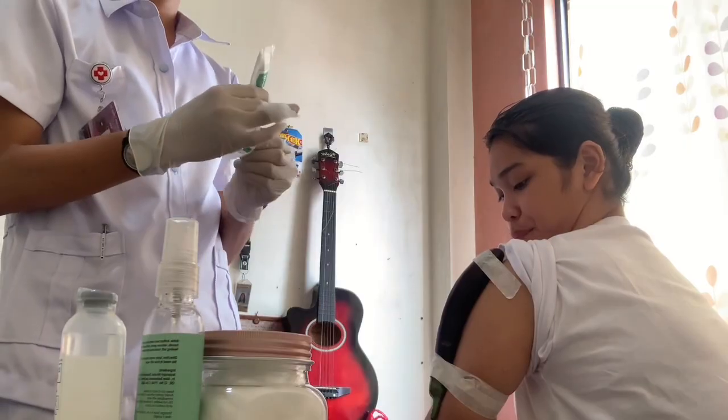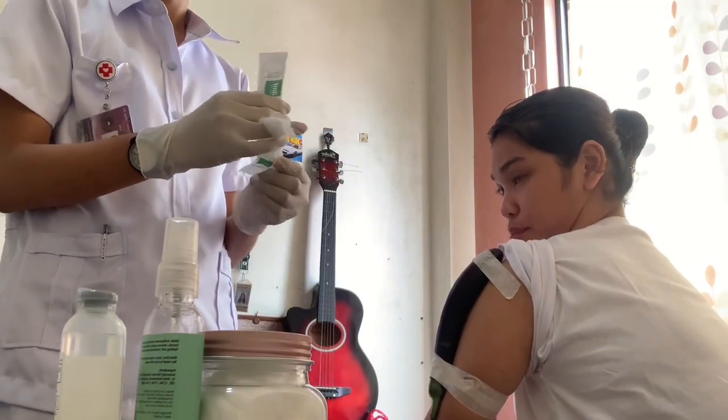Next, prepare the syringe. Ensure that the connection isn't loose.